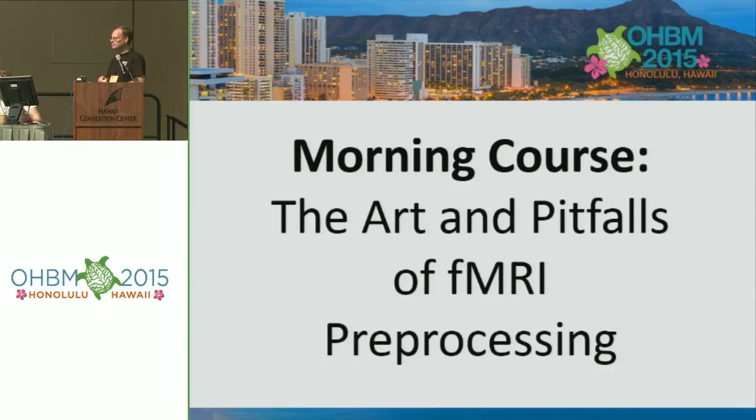So you're actually smoothing a lot throughout. Pretty much every step that we use that has these 3D spatial processes does introduce some level of smoothing. So it's easy to say we're not smoothing data, but you have to be very careful about that sentence. We do smooth a lot. We just don't smooth with the kernel that everybody does. That's what I think Mark is mentioning.